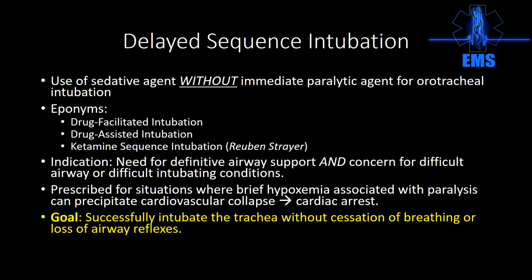It's prescribed for patients for whom brief hypoxemia associated with paralysis can precipitate cardiovascular collapse and cardiac arrest. So the patient needs resuscitation, but maybe they will not cooperate with that. They have a behavioral emergency, or they're hypoxic and now they're combative and agitated, and we need to be able to ventilate the patient, but they're pushing the bag off or they're pushing the CPAP off.